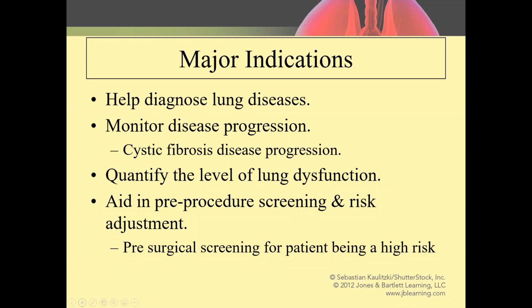Monitoring disease progression. I'm picking on cystic fibrosis patients, not to be in any way discriminatory, but it's common for individuals diagnosed with cystic fibrosis to have what's called serial pulmonary function testing.